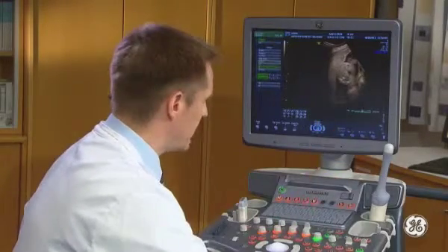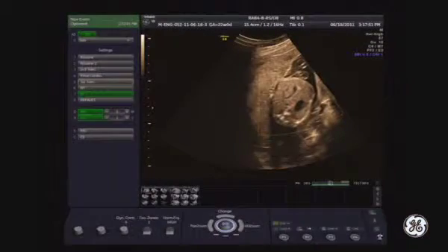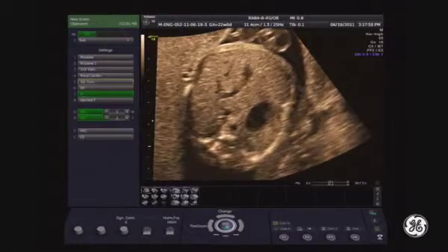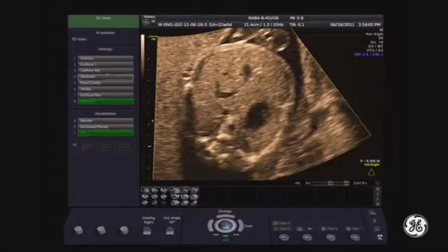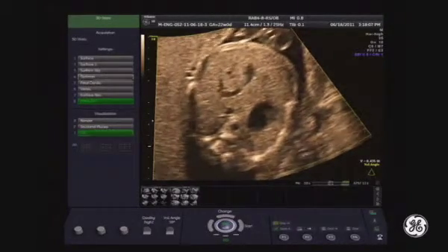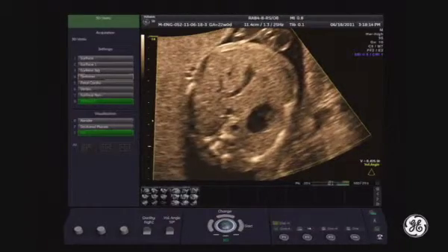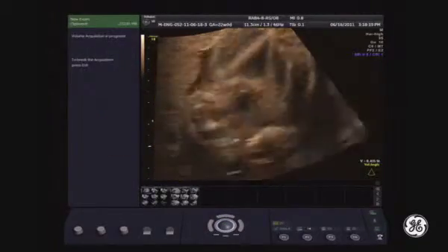with the direct insonation. So I will zoom this area, and afterwards I plan to acquire a 3D volume. This is the 3D frame, as you know, from the previous examples. My settings are quality high 2 and the volume angle 50 degrees. I observe the fetus. It looks quite still, and finally I release the acquisition trigger.